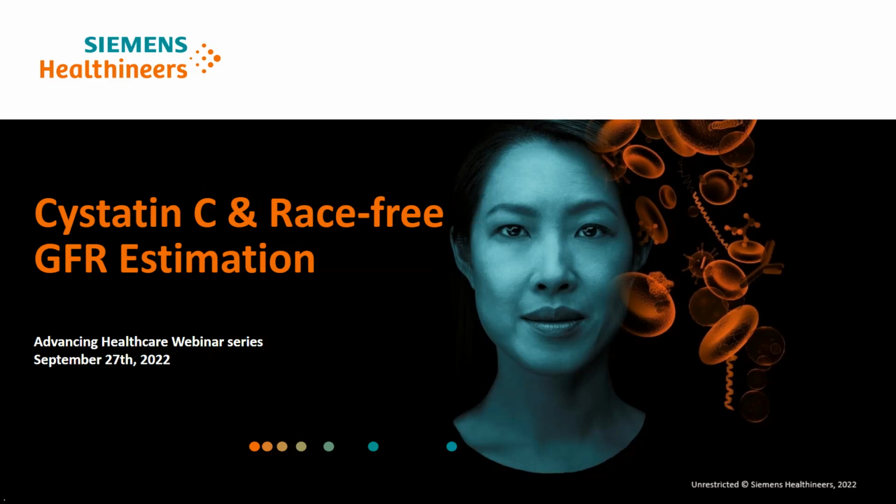Yes, thanks so much. So I can just summarize what was at the end of my talk since that was missing for those who are watching this live. In the last part of my presentation, I was talking about some of the barriers to cystatin C testing. The main ones are the lack of widespread availability of tests in-house for cystatin C. Most clinical laboratories send out for cystatin C testing, which obviously will slow down your turnaround times, and not make that result available at the same time as a creatinine-based eGFR.